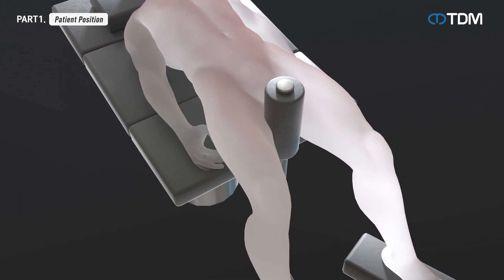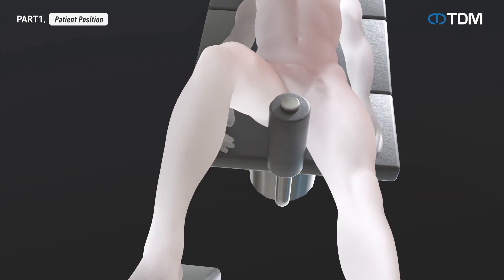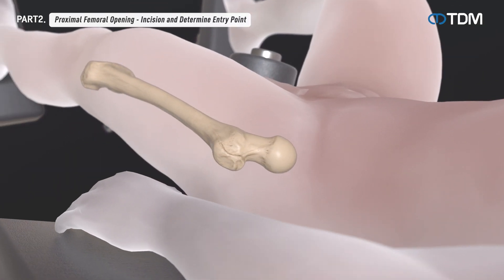Position the patient in the supine position on the table for the procedure. The unaffected leg is abducted as far as possible to ease image intensifier positioning, which will also allow easier access to the entry point. Make an incision in the surgical site.